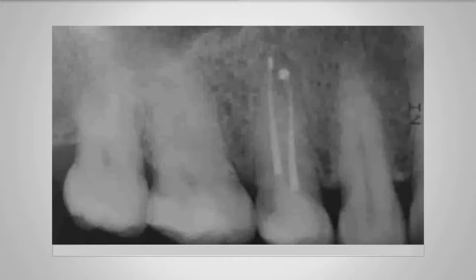You want to use the largest file that's feasible, really. So although I started on a size 6, this is a tiny, tiny canal. I'd normally start with at least a size 10, but if the reading seems to be a little bit inaccurate or a little bit variable, then I'd go up a size. You need to be aware of short-circuiting on metal restorations as well. And with practice, they can become really, really accurate and really reliable. Okay, let's continue.